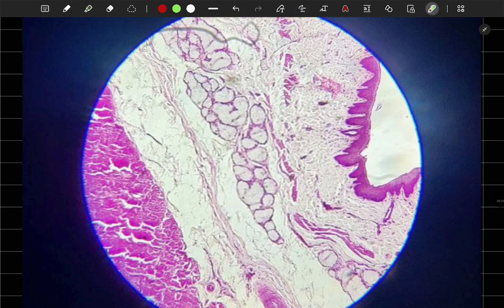So hey guys, this is a special video where I will be covering all the gastrointestinal system except the large intestine and the appendix. The reason I am covering this in one video is because all the gastrointestinal system slides are of 4-layer structure and luminal. So how to differentiate between them?